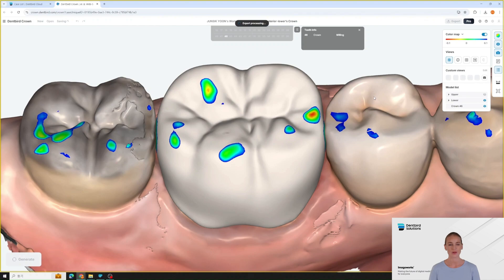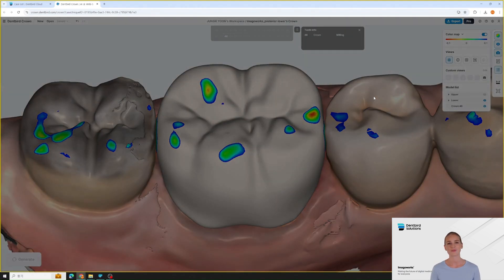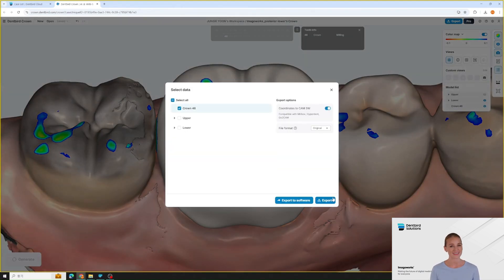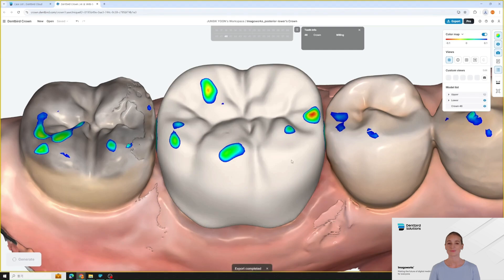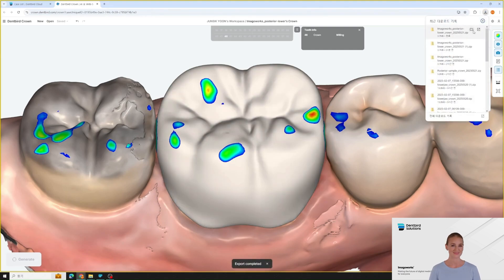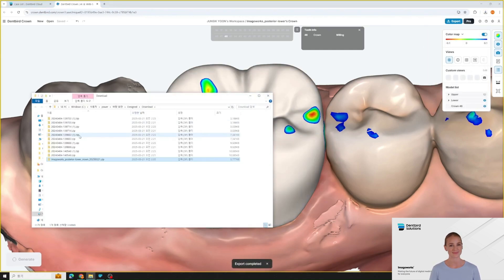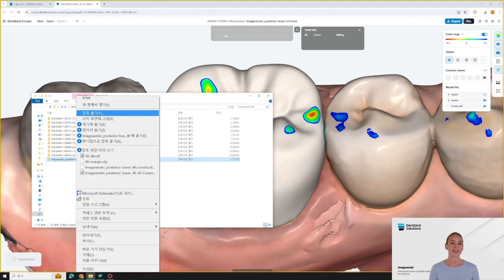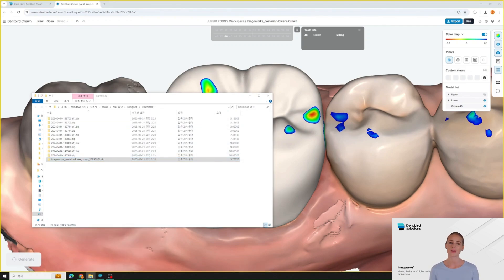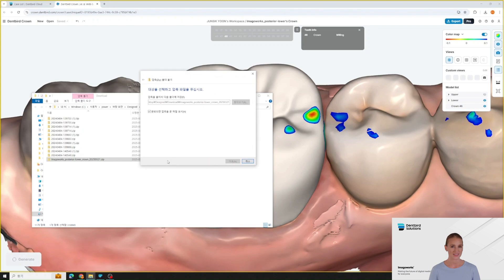When you click export, the file is downloaded as a compressed file to the designated path. You can see that the facet areas of the surrounding teeth have also been harmoniously reproduced. In this way, DentBird enables fast and efficient crown production with consistent, high-quality results.